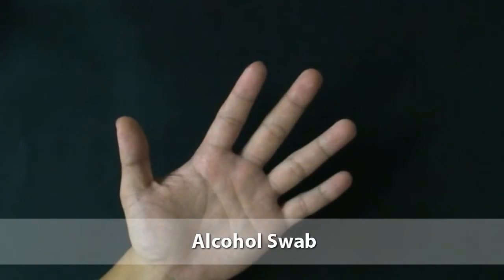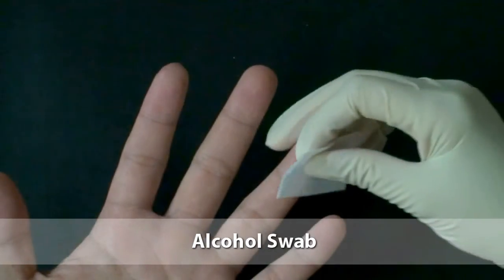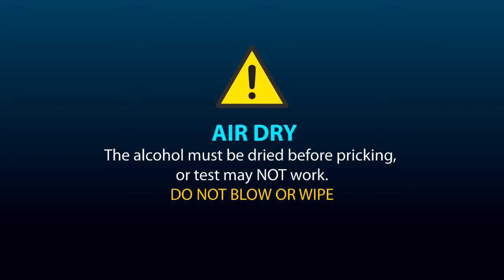Grasp the fourth finger of the patient's hand and clean the finger thoroughly with the alcohol swab. After cleaning the finger, it must be allowed to air dry. Remember, the alcohol must be dry before pricking, or the test may not work. Do not blow on or wipe the finger to dry it.